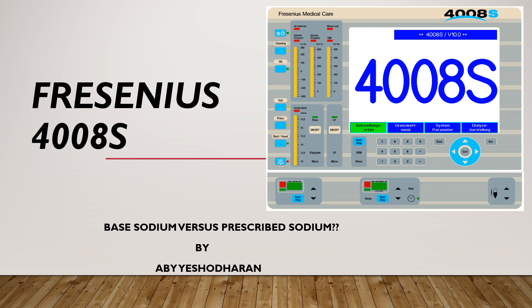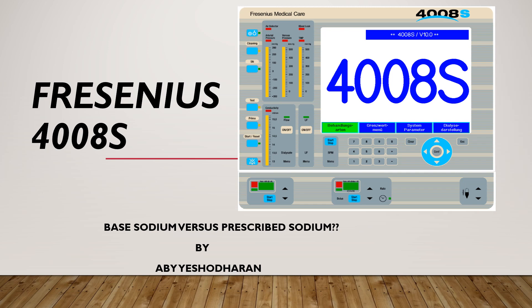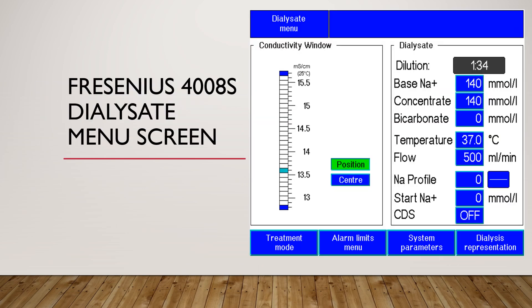Base sodium is the total sodium concentration present in both acid concentrate and bicarbonate concentrate after mixing by the 4008S machine. If you look at the screen in the video, you can see a base sodium of 140 millimole per liter, and just below that it is displayed as 'concentrate.' However, on machines sold in India, instead of 'concentrate,' it will be written as 'prescribed sodium.'